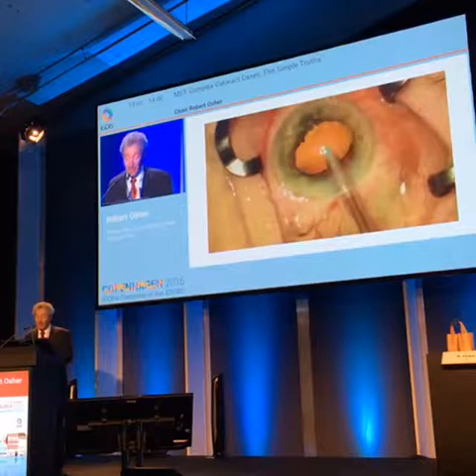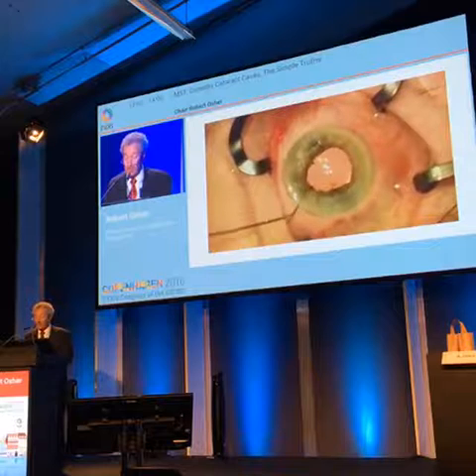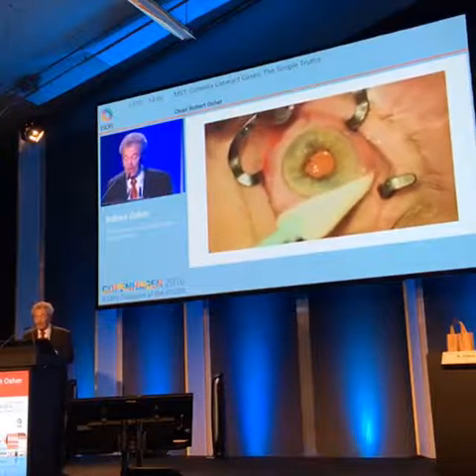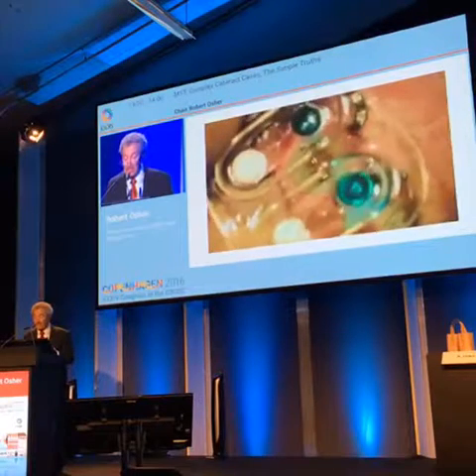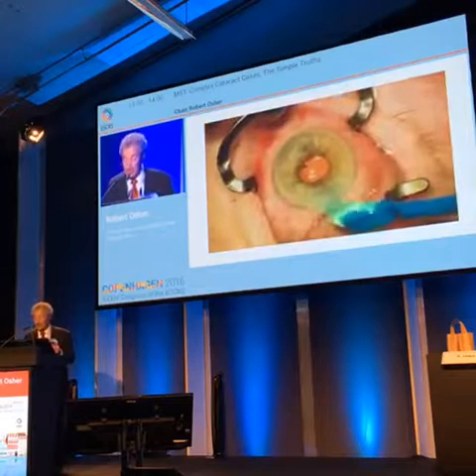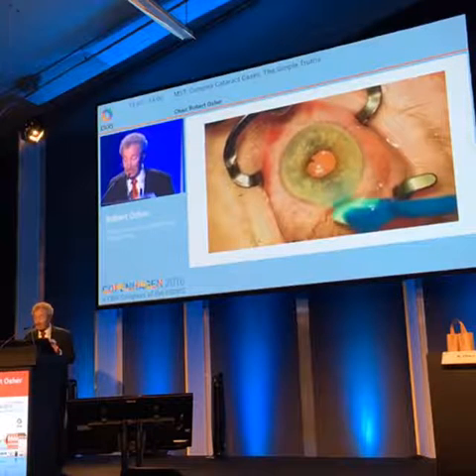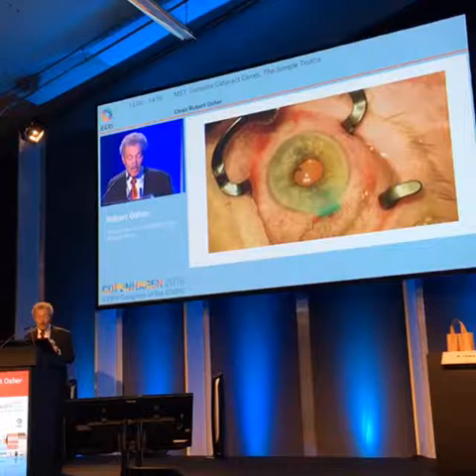This patient, by the way, is on Rapaflo, which is just like Flomax, but worse. So the iris doesn't look as good as I would normally like it to look, but still, she has a safe lens, and because of her Alzheimer's, I'm going to seal her incision and take no chances with her rubbing her eye. She's also on anticoagulants.